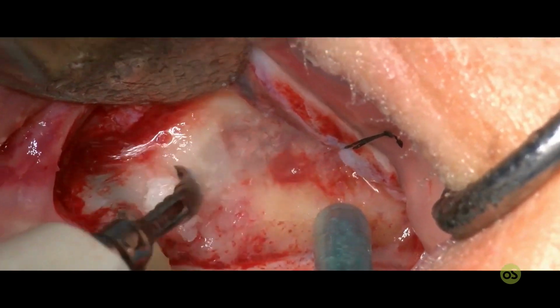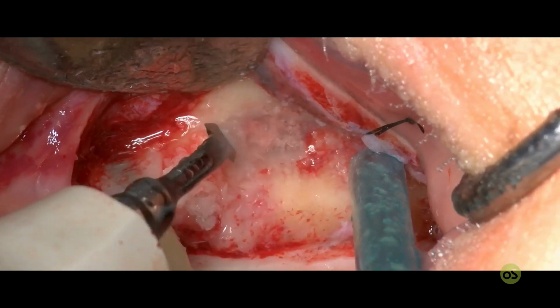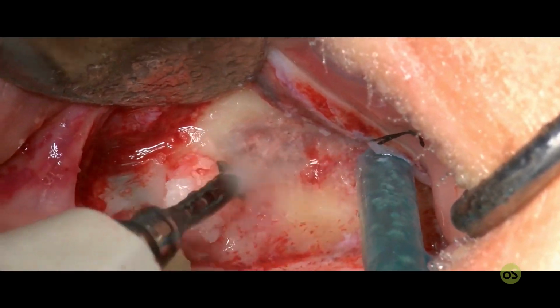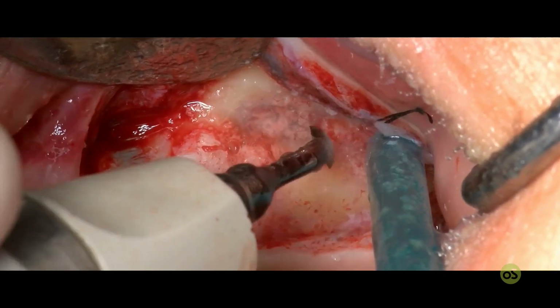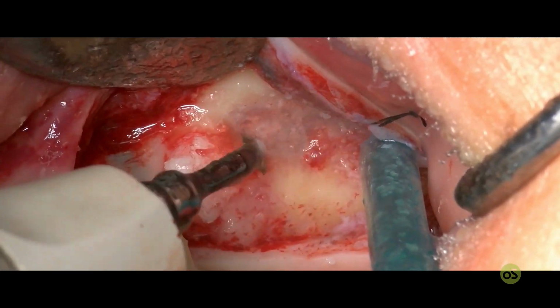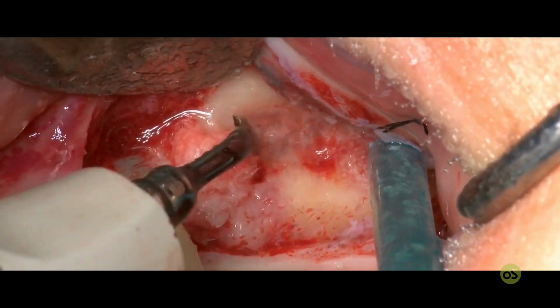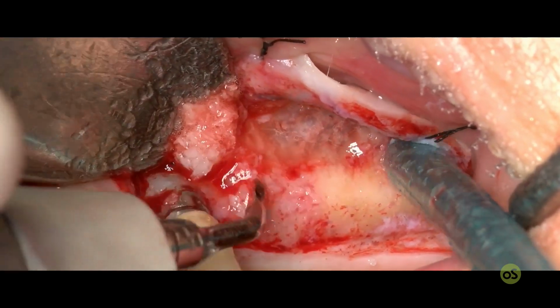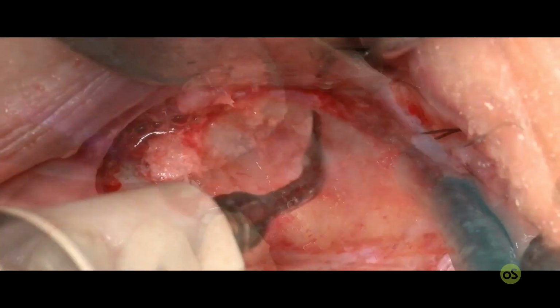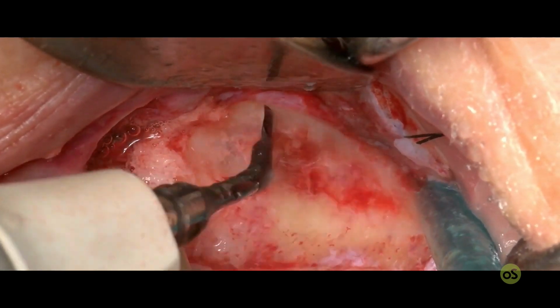Now you can see that with this maneuver we are reducing the thickness even in the area of the first molar. In this area, usually, we have the zygomatic process. For this reason, I prefer to avoid opening the sinus bony window in this area, to avoid reducing the resistance of the skull. But in this case, it was necessary to do that.